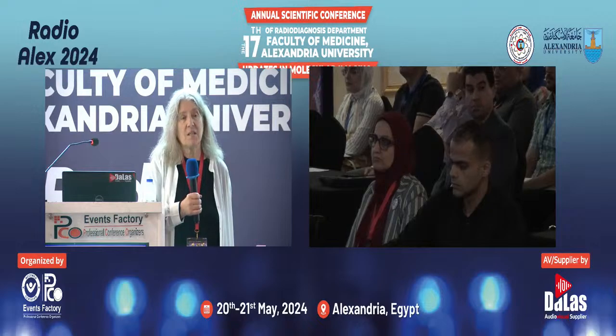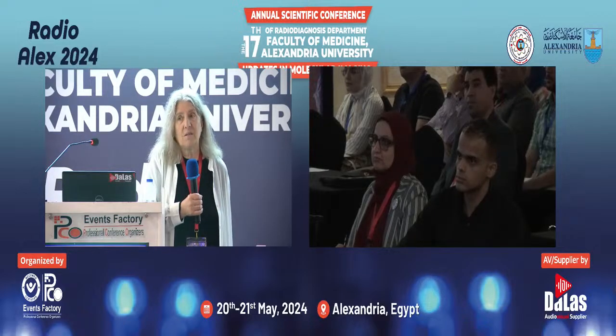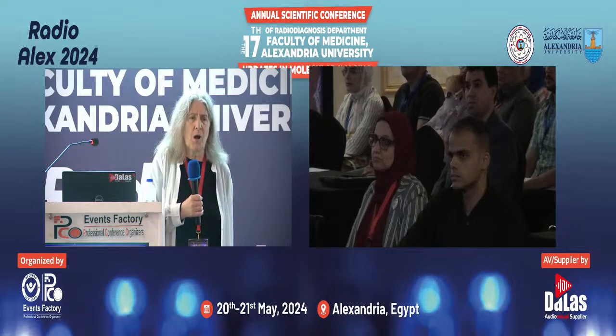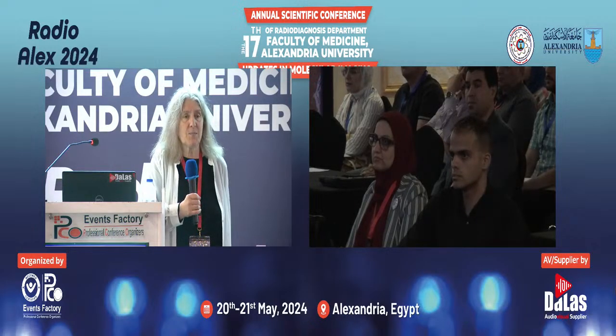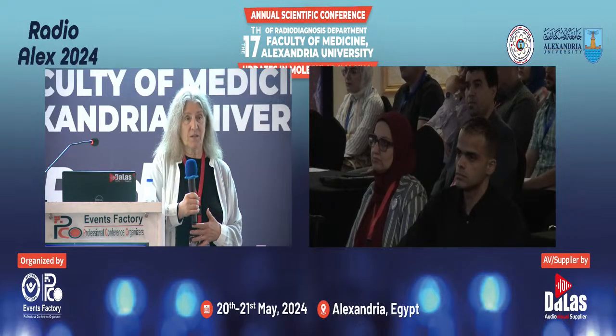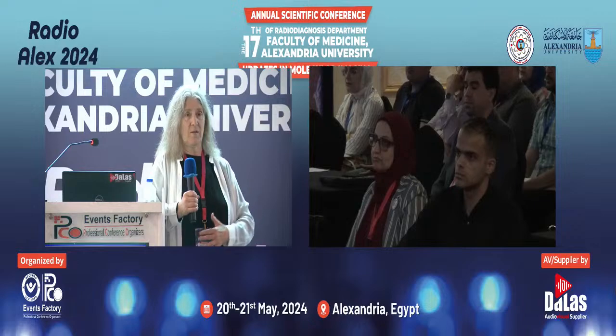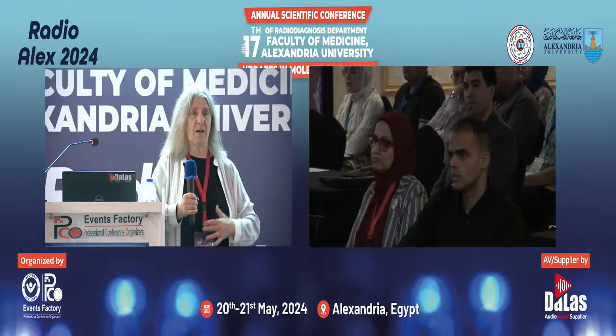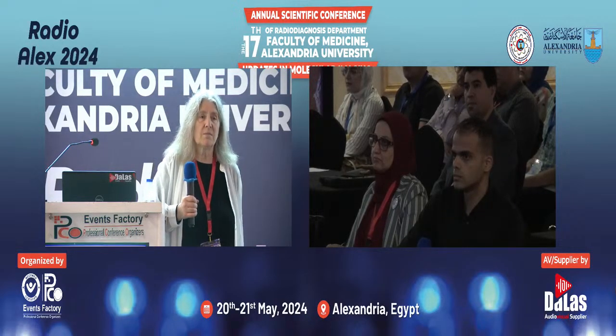Little kids, little teeny children, are usually sedated for a PET scan because a PET scan takes about maybe a half hour, so you can image longer. But if you need to do respiratory gating, you can. But the respiratory motion is not usually a horrible problem with PET. But MRI, in my experience, MRI of the liver in a small child is difficult because they breathe, you know, their abdomen goes up. Adults breathe with their chest. Little kids have a lot of abdominal excursion with breathing.